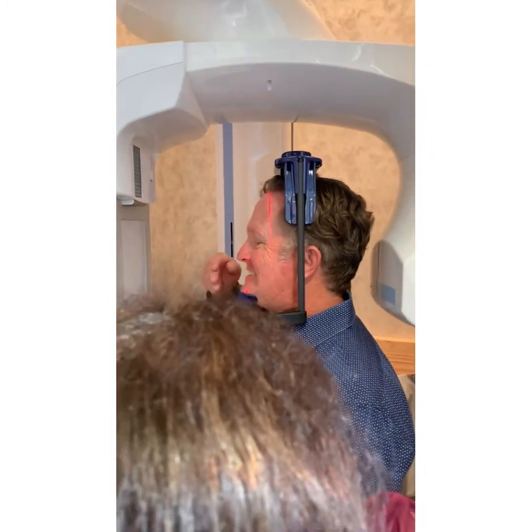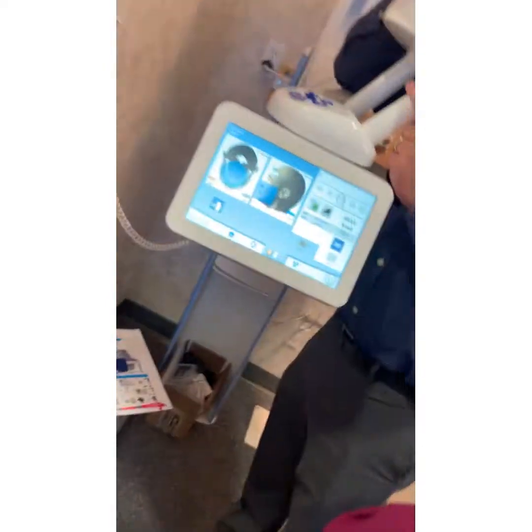Smile. And you're saying that's right in front of it? Come over here. You're sitting in the wrong angle. You have to look from right here. You'll be in Nina's spot. No, even more. Right over there. See it? See that line? It's right in front of his front teeth. What line? Okay, look. See that red line on his nostrils? Follow that. Pretend that's a line going down. It's right in front of his teeth, right? It goes from here to his chin. It's in front of his teeth.